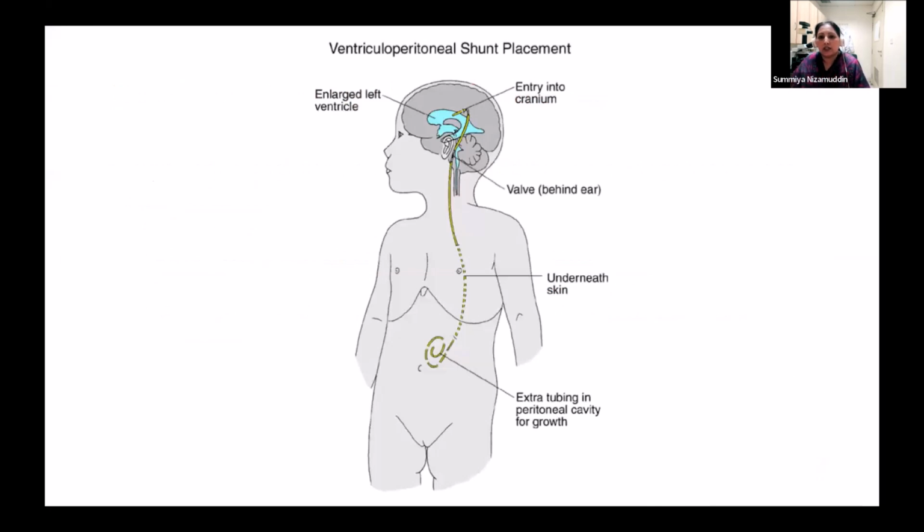In case of patients with VP shunts, and if you're going to be sending samples from a VP shunt, it's always better to let us know कि sample कहाँ से, कौन से end से लिया, whether the sample has been taken from the exteriorized ventricular end or from the peritoneal end. It's always better to please let the lab know. And of course, if you're taking samples from the reservoir, once again, please let the lab know कि आपने sample कहाँ से draw किया है.